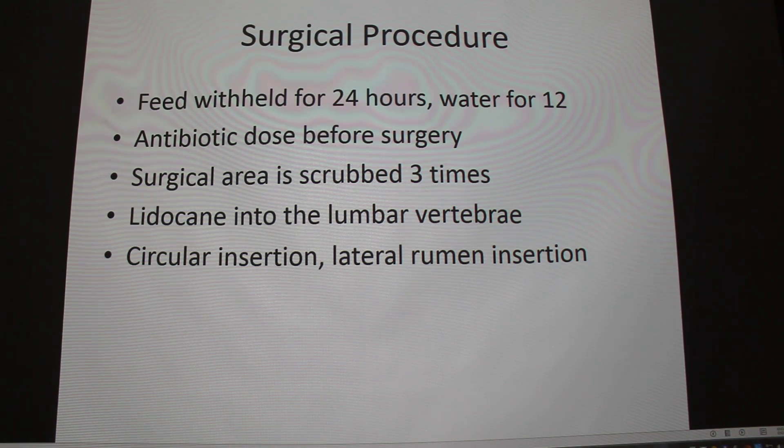So you scrub and shave it down — it's the left paralumbar fossa. It's always on the left side. The rumen tends to be on the left side of the abdominal cavity. And we can also talk about a trocar and bloat — if you have a cow in bloat, you put the trocar in the left paralumbar fossa, and you have to do this in emergency cases.